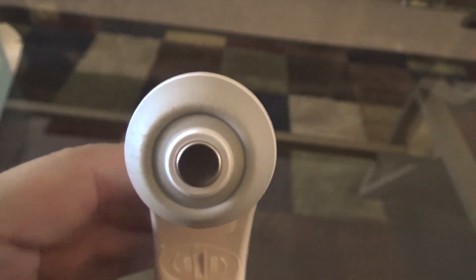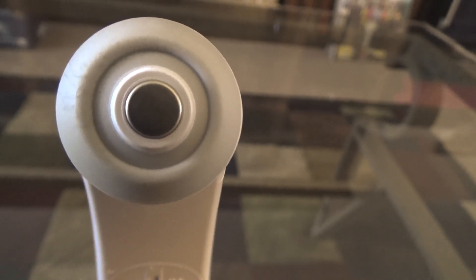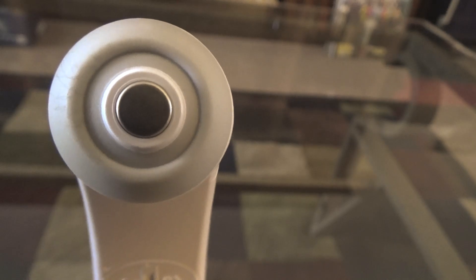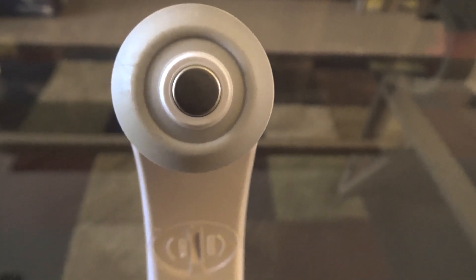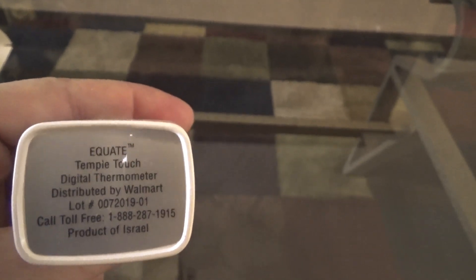This sensor right here is what you touch to your temple on your forehead. Be sure to clean it after every use, or before every use, because if you have any oil or anything on your skin it may interfere with the thermometer reading — the oil may act as an insulator. That's just my guess, but it's one of my pet peeves. I also noticed that it is made in Israel and packaged in China.